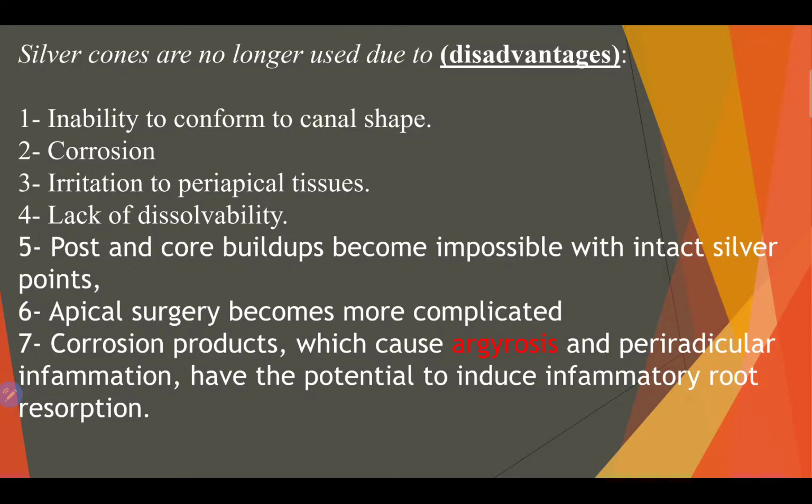Corrosion: the corrosion products occur after some time in the root canal.